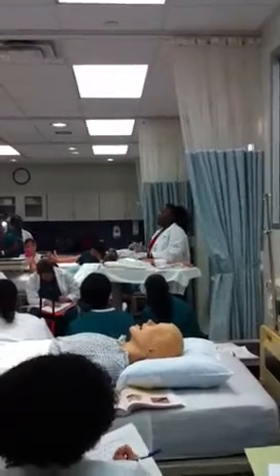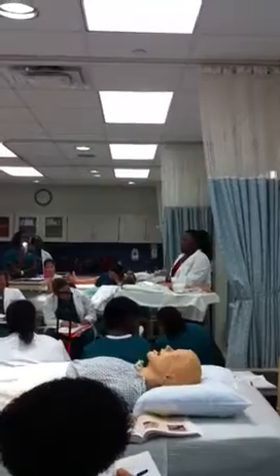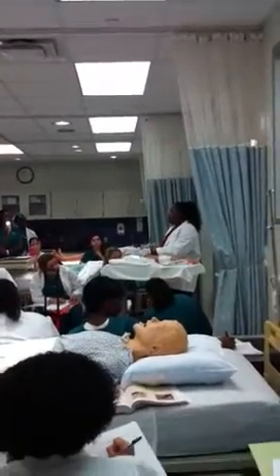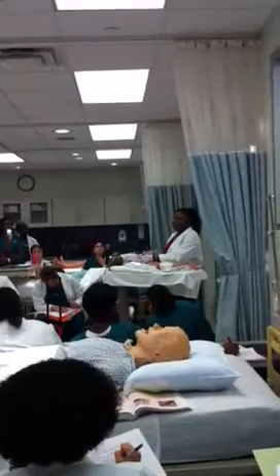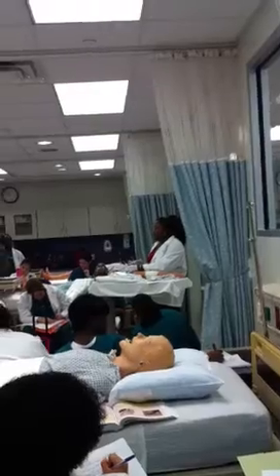When you give sub-Q, this is another critical element. When you give sub-Q, you have to what with the skin? Pinch or spray? Pinch. You got to pinch the skin.